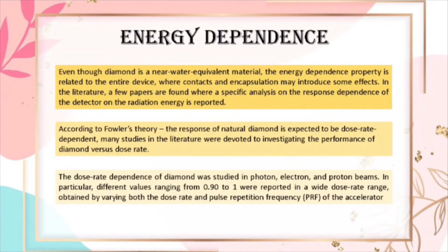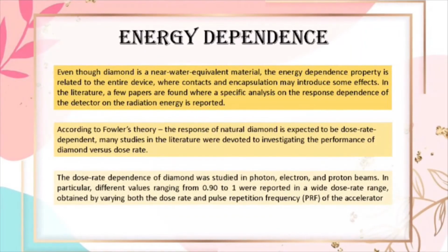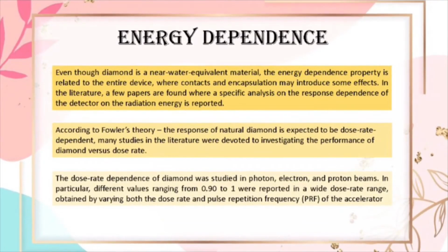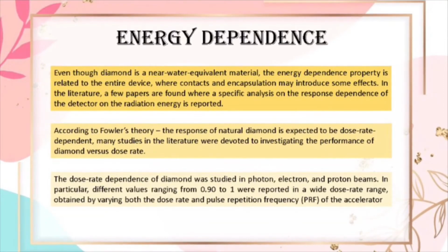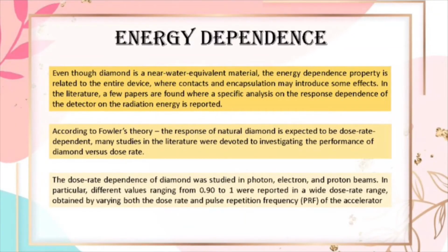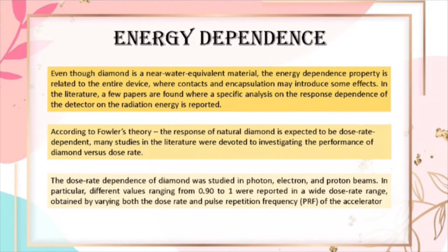Lastly is energy dependence. Even though diamond is a near water equivalent material, the energy dependence property is related to the entire device, while contacts and encapsulation may introduce some effects. In the literature, a few papers are found where a specific analysis on the response dependence of the detector on the radiation energy is reported.